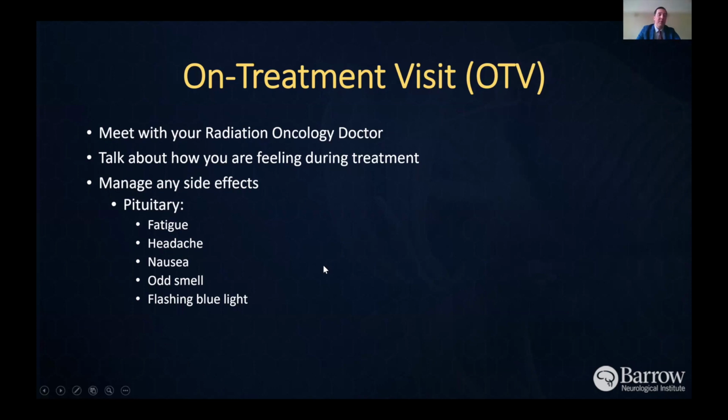And sometimes people can experience a flashing blue light during the radiation treatment. That's actually called Cherenkov radiation. I won't nerd out again, I've already done it once. They only occur when the radiation beam is on, typically, and they don't necessarily predict damage to the actual senses, vision or smell, but they're things that patients describe to me on occasion, specifically when we're treating a patient with any sort of pituitary tumor, acromegaly included.